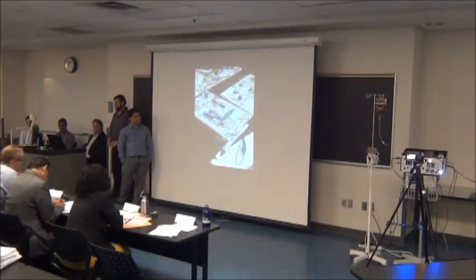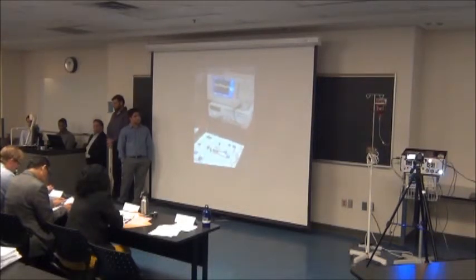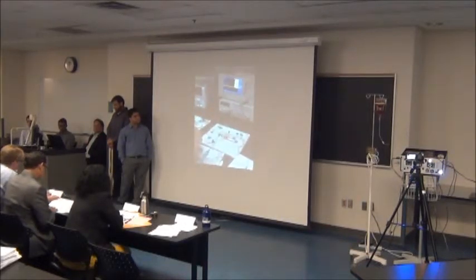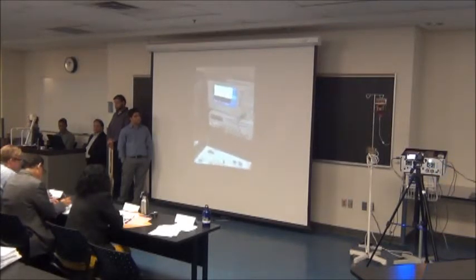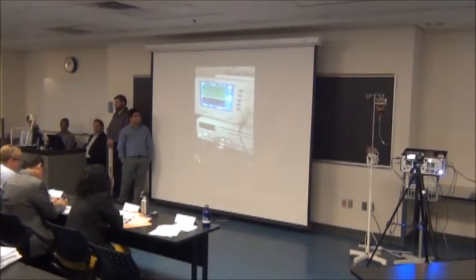So let's see what's going on with the frequency multiplier. Can we show that frequency multiplier on the scope? Okay, so it's taking that low frequency and multiplying it. I'll just change the time division so we can see it a bit.